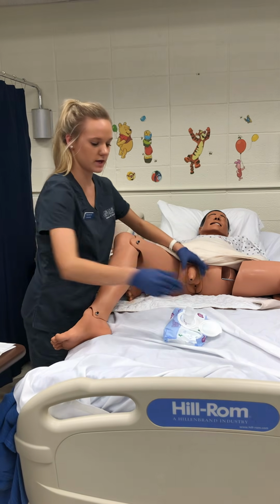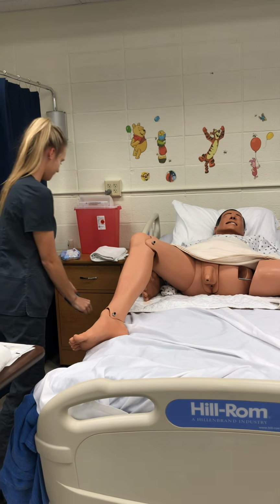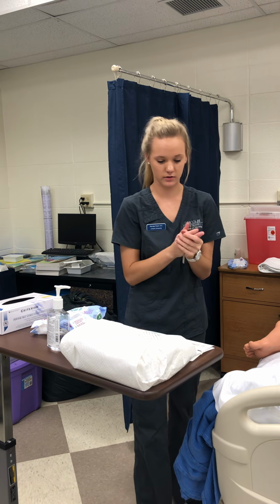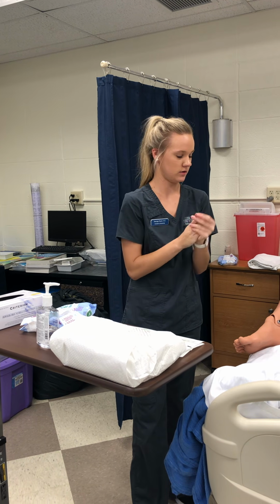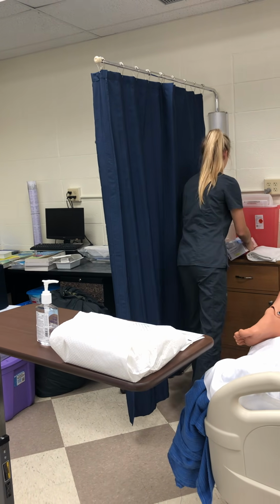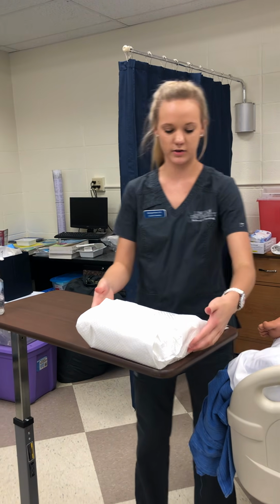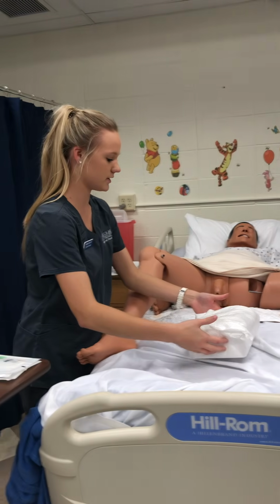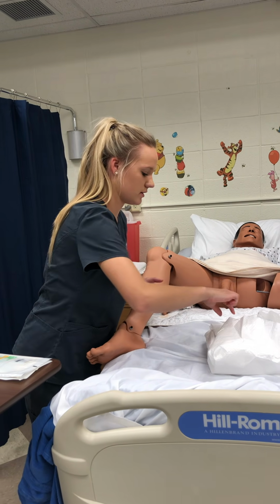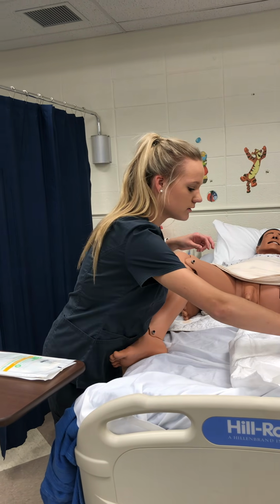Okay, I'm going to go ahead and take off my gloves, perform hand hygiene. I'm going to go ahead and move my wipes and gloves out of the way for the moment. I would want to make sure before starting everything that my table is clean. I'm going to go ahead and set up my sterile field in the bed, starting with it away from me, and then to the sides, and then towards me.